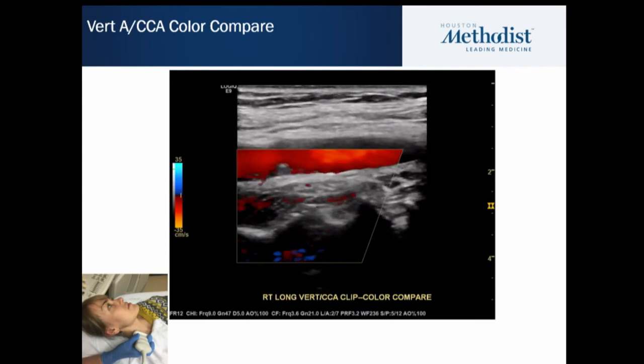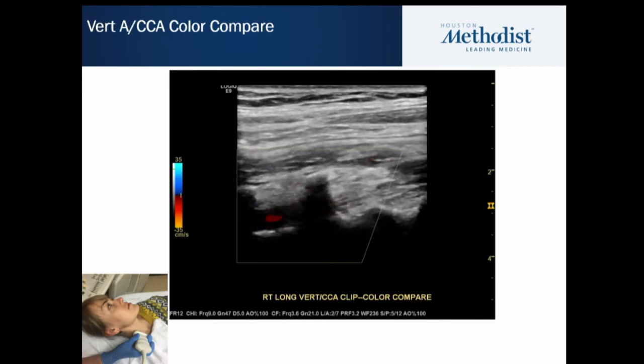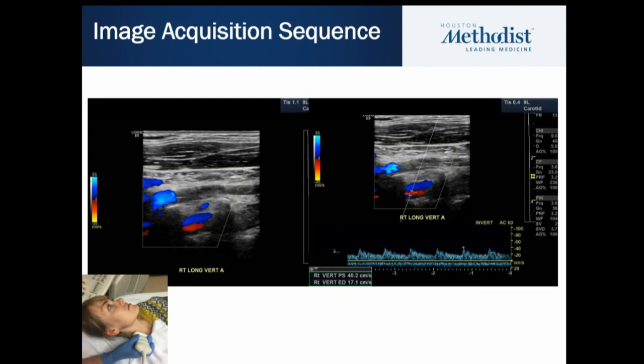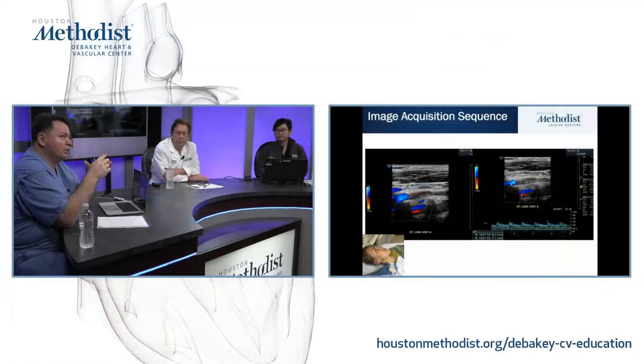I think do you have that vertebral slide? We inserted one vertebral slide, and we wanted to show purposely one clue: the vertebral vein and the artery go in different directions, in two different colors. What if they are the same color? That's obviously not good. The resistance of the vertebral artery tells you that if it's a reverse, it needs to be high resistance. So there's a bunch of clues.